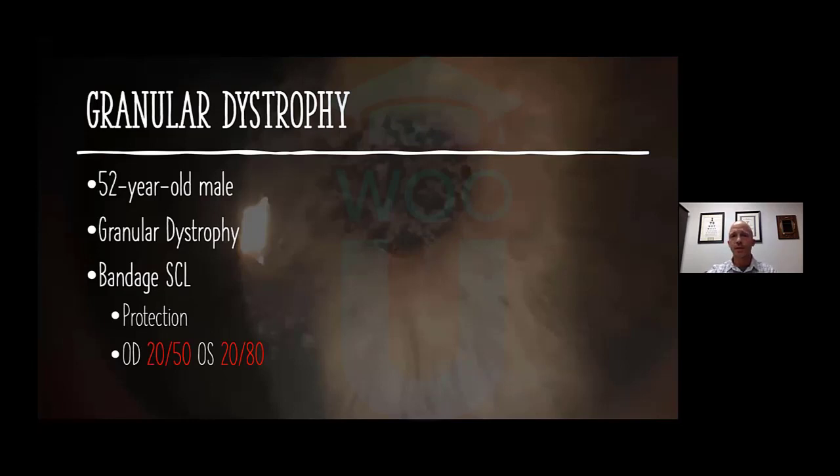So for this first example, this is a 52-year-old male patient of mine that came to me with granular dystrophy. And this patient had been for years wearing bandaged soft contact lenses, number one, for protection, because unfortunately with granular dystrophy, the surface can get rough and they can get these punctate epithelial erosions or abrasions that cause them some significant discomfort. And these bandaged lenses, by the way, did have power to them, including, I believe, one toric soft contact lens.